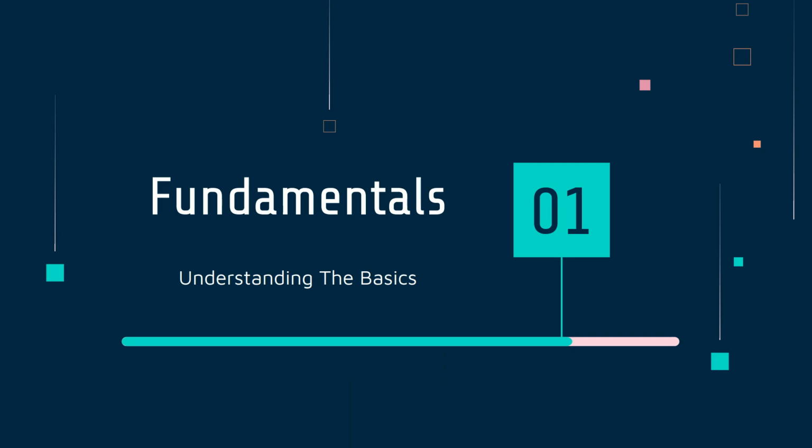So the first thing you're going to be looking at is a fundamental concept of computer vision. You're going to be using YOLO, which is basically a neural network. So we're going to understand how computer vision utilizes neural networks to do things like object detection, segmentation, and all that. You're going to take all that basic knowledge and apply it in building our final model in LightlyTrain.